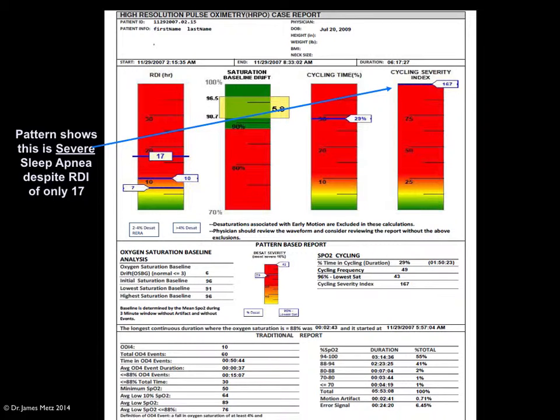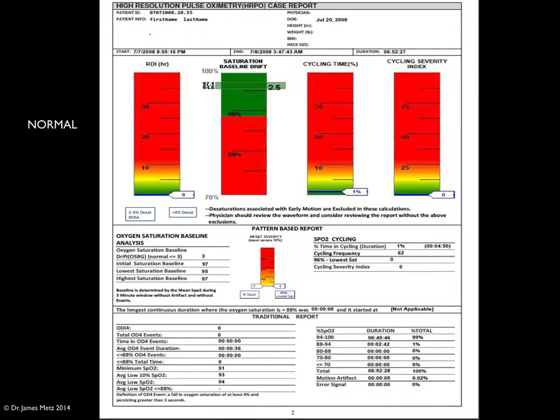So you essentially have an initial study, then you titrate the appliance, and then you get a clearing study at the end. After the initial study that shows that the patient has sleep apnea, the physician will write you a letter of medical necessity, and that's what will allow you to go ahead and treat.